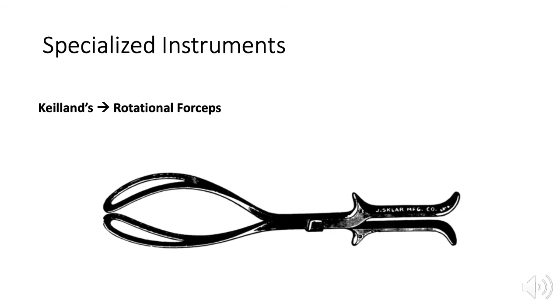It's important that before applying the forceps, you do a false application and hold them articulated with the knobs facing the occiput.